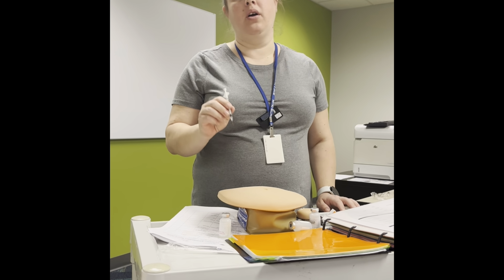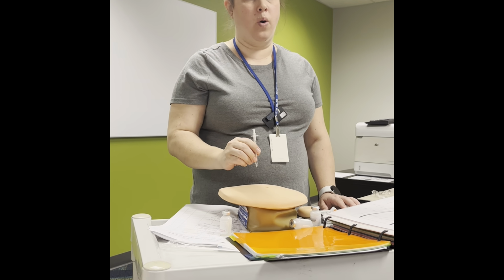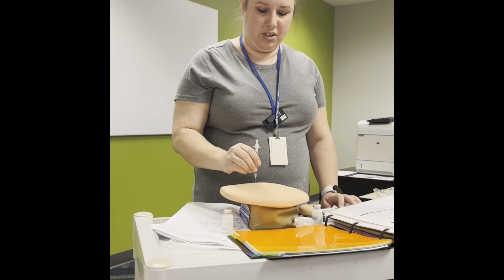In real life, somebody that you're giving their insulin shot, be nice. Just kind of ease it in there. No diabetic wants you to jab at them. We're just gonna put it in there.